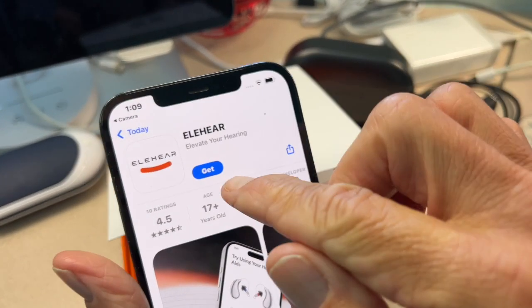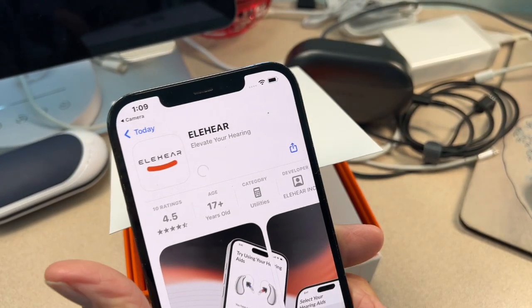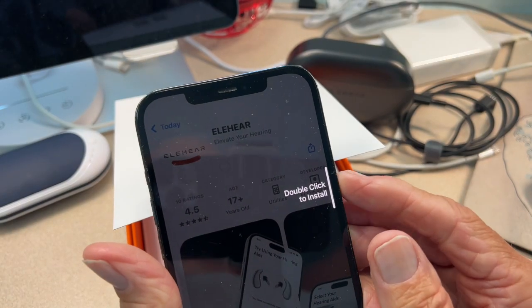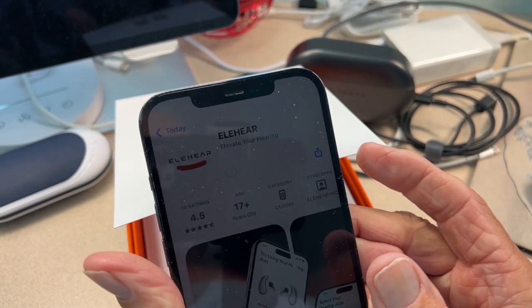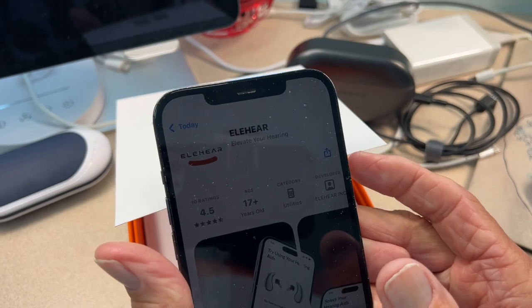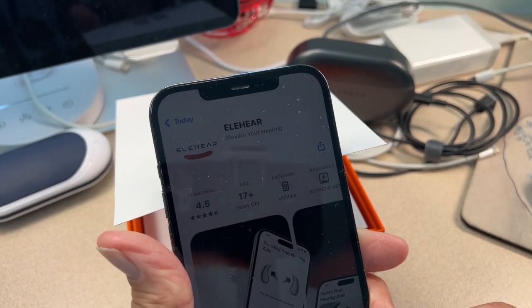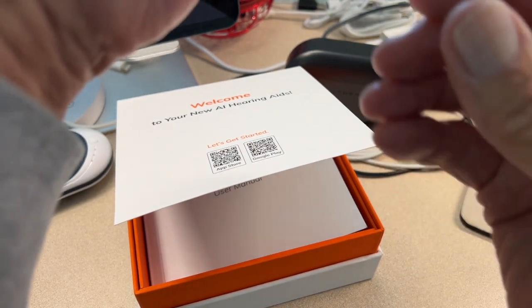And basically all I have to do is hit get. You know what I mean, jelly beans? So I just hit get. And then it's asking me if I want it. I got to double click. And then I've got to install it. So I've got to go down to the bottom and install it, which I'm going to show you right here.